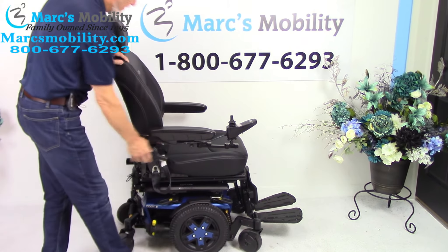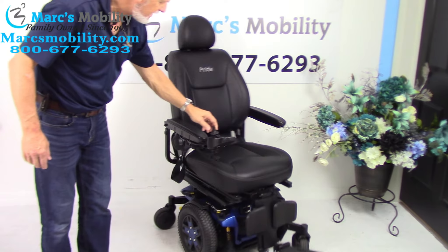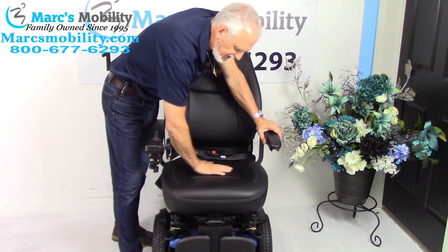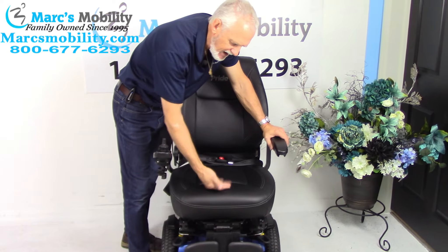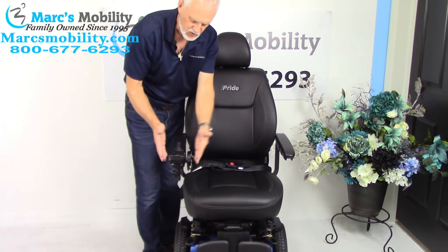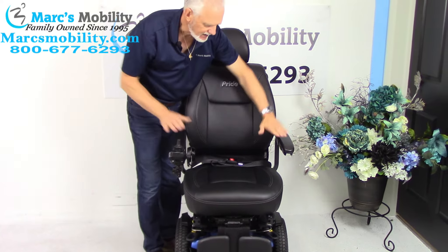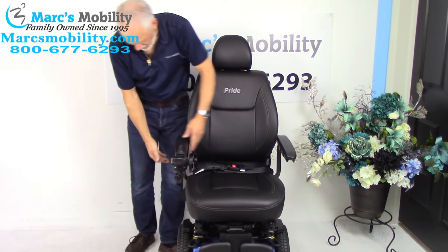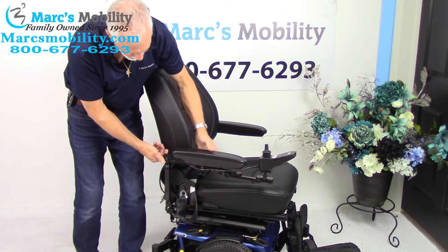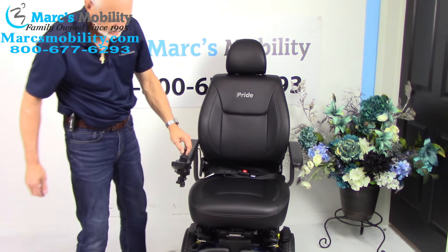The seat on this chair is a high-quality captain seat that comes with these high-end chairs. It's a breathable seat with little holes in it — if you sit on it, the vinyl breathes. This is a 20 by 20 seat with a high back and headrest. The joystick is on the right but can be put on the left. The arms go up and down, can go out, and there's a set screw on the side of the arm — loosen it and you can pull the whole arm up.